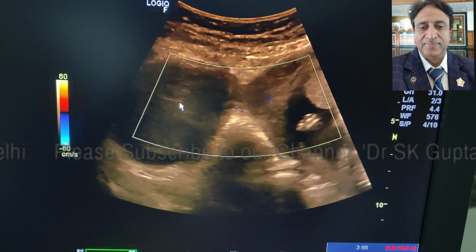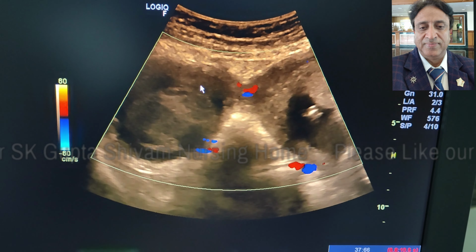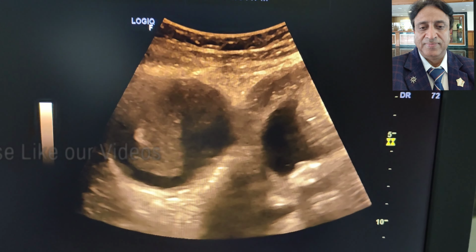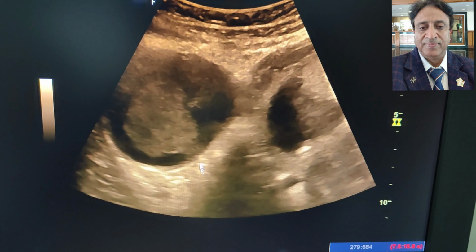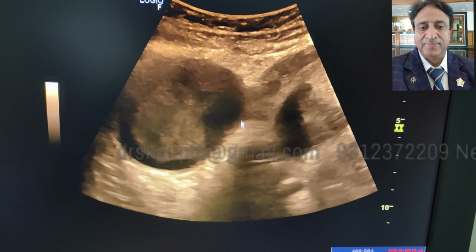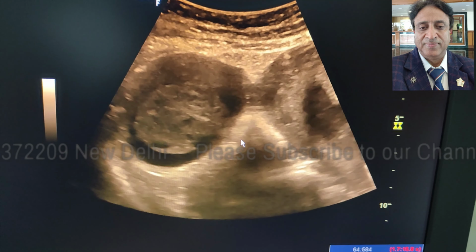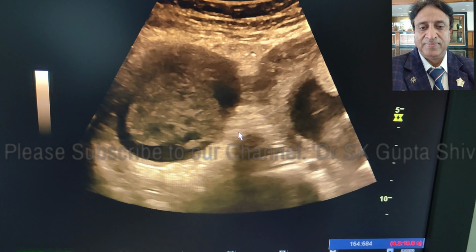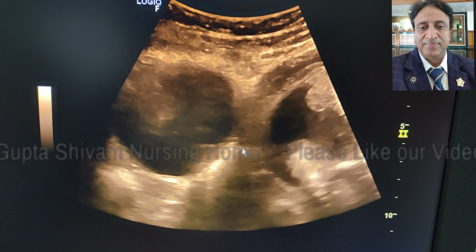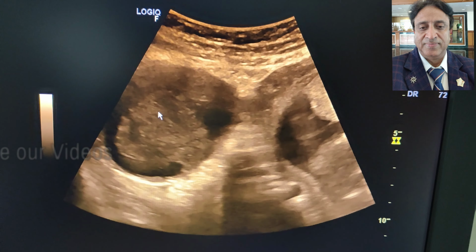When I take my probe transversely from the pubic symphysis upwards, I find that there is a rudimentary horn on the right hand side, and there is another horn which is carrying the live pregnancy. Another possible differential diagnosis could be a twin pregnancy in the same horn of the uterus, but there is a tissue over here which appears to be uterine wall. It does not appear to be the amniotic band or the amniotic membrane which is dividing the two sacs, and there is no separate placenta over here. So probably this is a pregnancy in the rudimentary horn of the uterus.